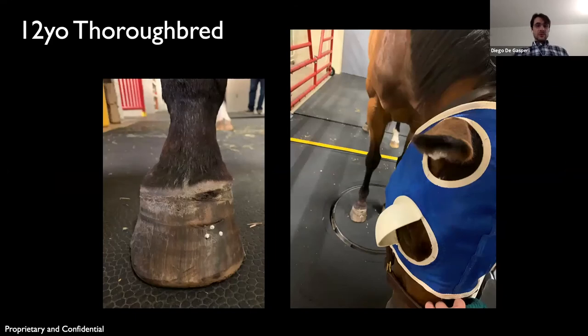So we move on to now, this is not a navicular case, as you can guess looking at these images. This was a 12-year-old thoroughbred, I'm sorry, with a history of a right front limb laminitis and chronic abscesses associated with that laminitis. We CT'd this horse initially to confirm the presence and the extent of the infection. What we see on this image is the affected foot, the horse had a crack, and these are marks placed with barium paste. We also added some at the bottom here, just to help us define the extension of the lesion and prepare for surgery.